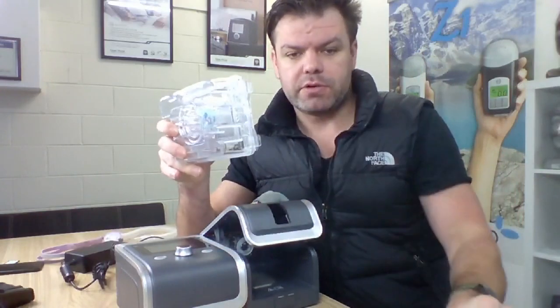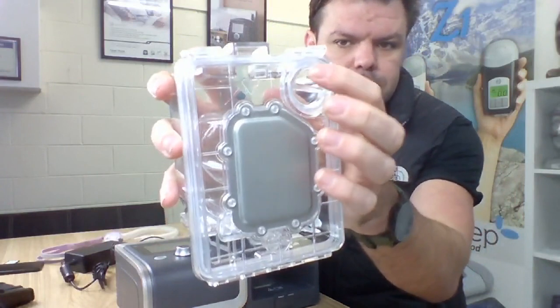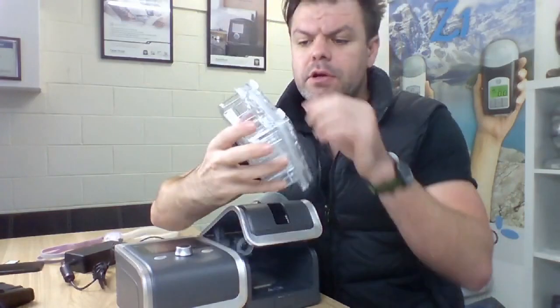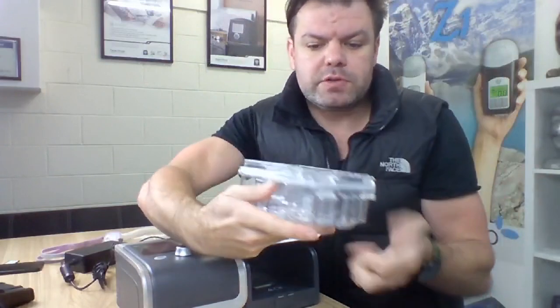All right, so to fill this chamber up, since it's new, it's got a sticker on it, so just pull that sticker off. It's got a little cap at the bottom here, and that's where we're going to fill the water up. So we just rotate that cap, the cap comes off, and then we fill it up here.